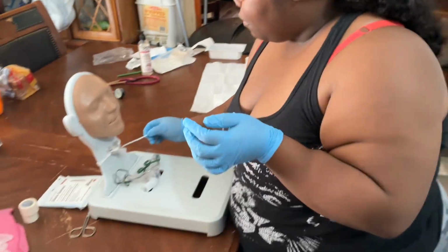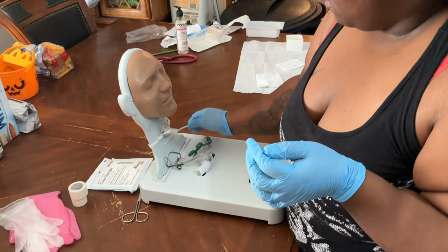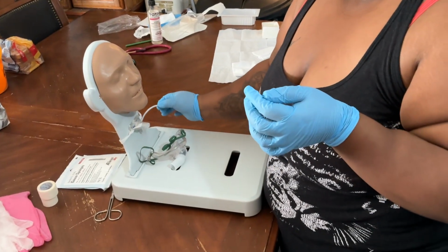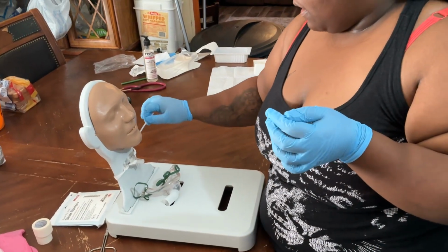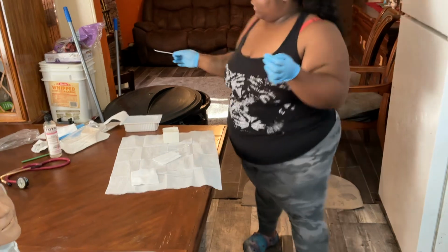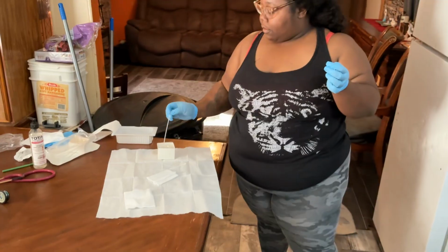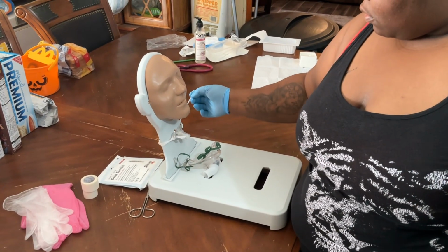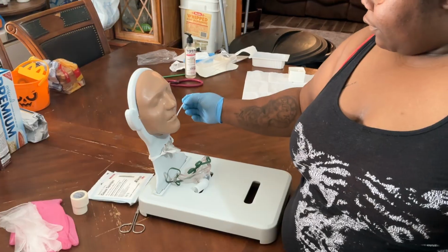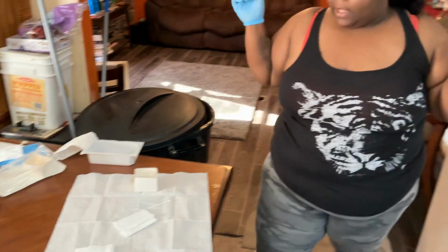I'm going to clean around my stoma to get any dried up secretions off of there, any dirty secretions. Okay, on both sides. Come around, discard that. Can get another one. Put it in my sterile water, clean water. Come around. Gonna clean up top, around my stoma. Careful not to reach over my sterile field. Come around my sterile field. Discard that in the appropriate bin.